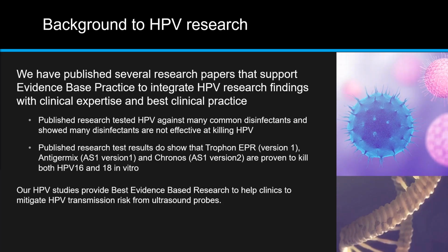We published research that tested HPV against many common disinfectants and showed that many disinfectants are not effective at killing HPV. And I want to point out here that many of the disinfectants that were labeled as high-level disinfectants, we found did not kill HPV. And this is because nobody had ever been able to test these disinfectants in the past. It wasn't until we were able to provide these high-level stocks of infectious HPV to do these studies.